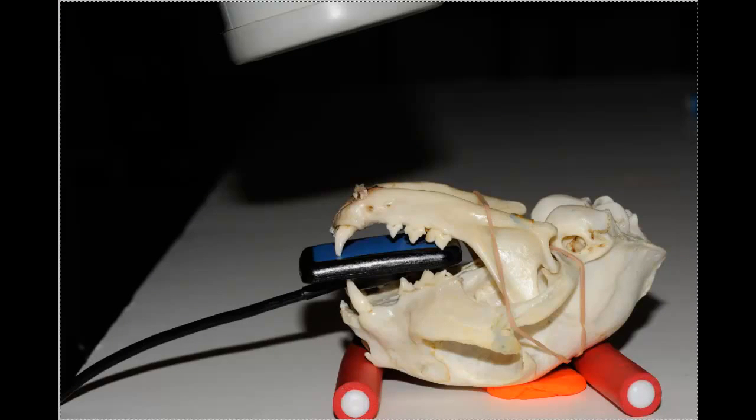Now, because we're working on a very small subject, and this applies to cats and also very small dogs like toy poodles or chihuahuas, where we want to keep the exposure time at approximately a tenth of a second or slightly higher. We don't want to really go below 0.1 seconds. So, if we're too dark at 0.1, we can always put a little bit of distance between the cone and the subject. Two, three, even four inches or more may help to cut the dose down to the animal, but allow us to keep our exposures at approximately a tenth or slightly higher.